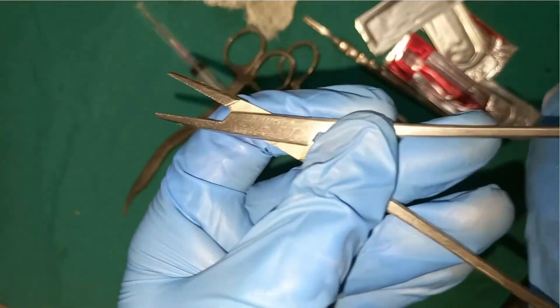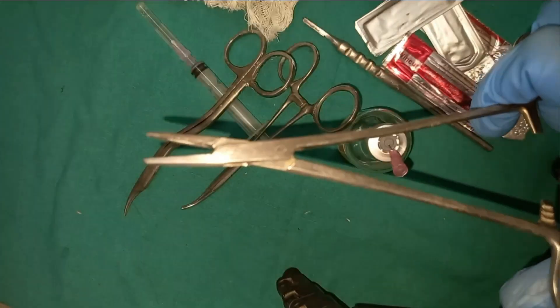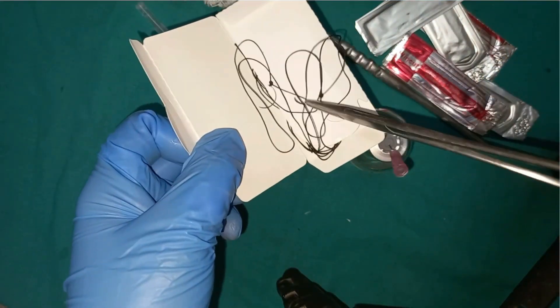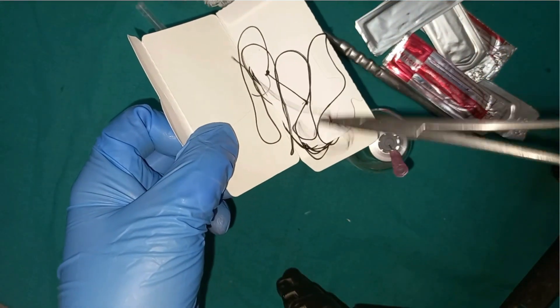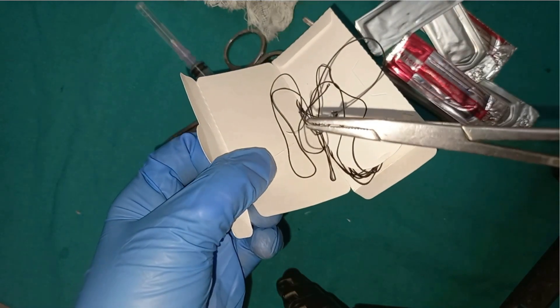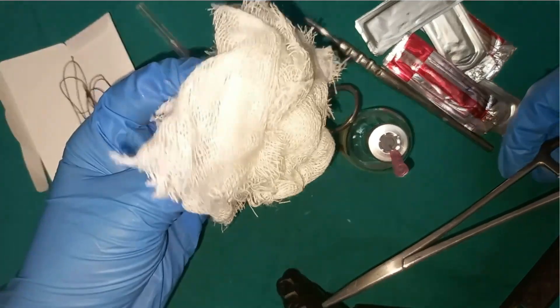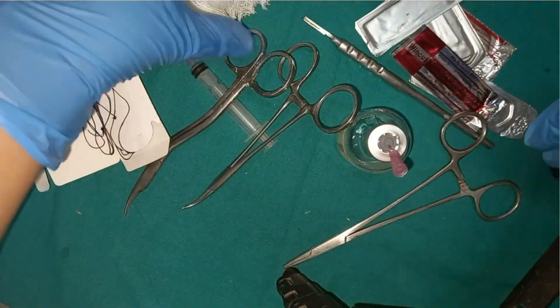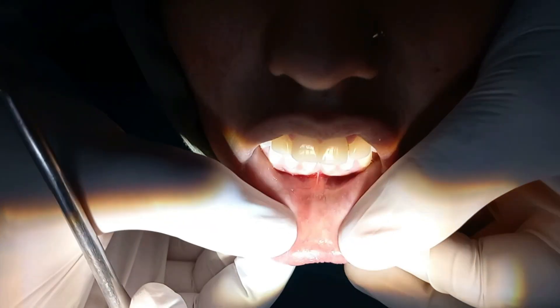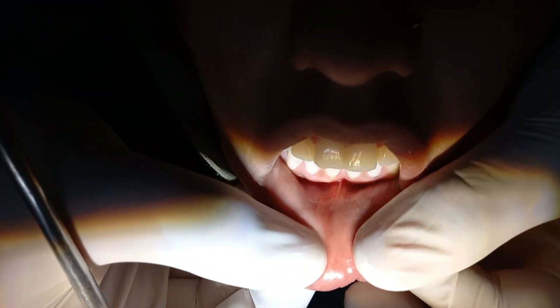We also need suture cutting and holding instruments so we can hold the needle and cut the suture. We require black silk suture and suture-holding forceps to hold the suture needle. The last item is sterile gauze pieces. This is all we need for the frenectomy.